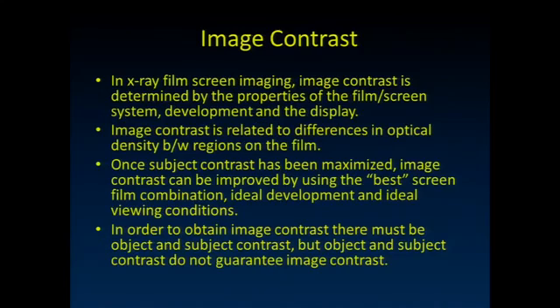Now, in the screen film imaging days, by the way, anyone in the room still use film for anything? In 2015, I think 5% of the country was still doing screen film mammography. My guess is no one's going to raise their hand and say that they're using any screen film for anything right now. Yes? Someone? MSK at one random tiny hospital. Okay, so still some people are, right?